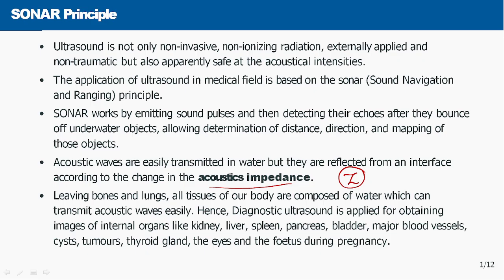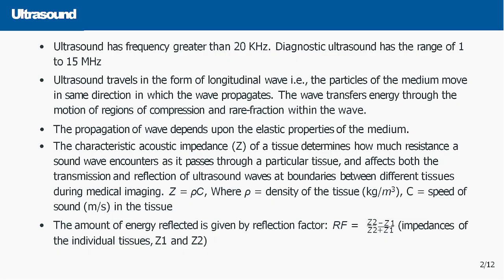All these can be detected or diagnosed using ultrasound, except bone and lungs, because lungs don't contain any water, and similarly bone does not. So these two cannot be imaged using these acoustic waves or this sonar principle.